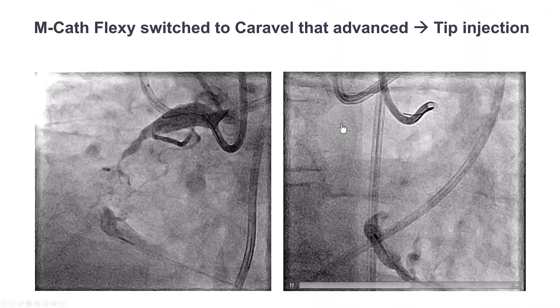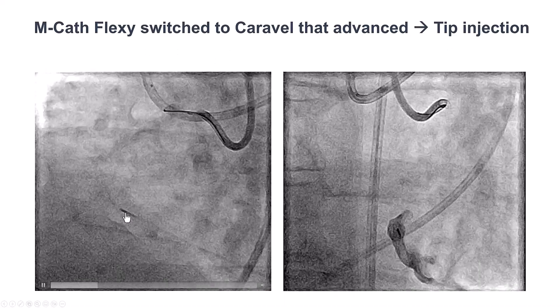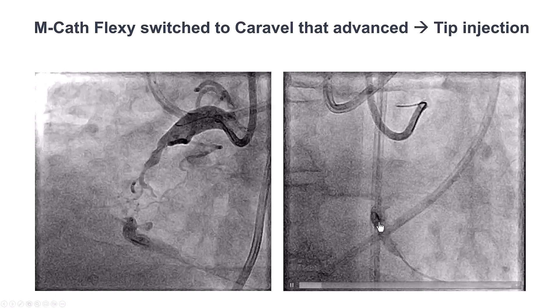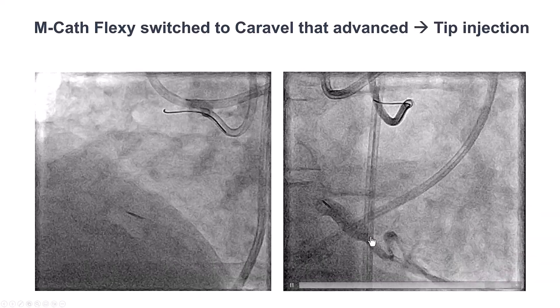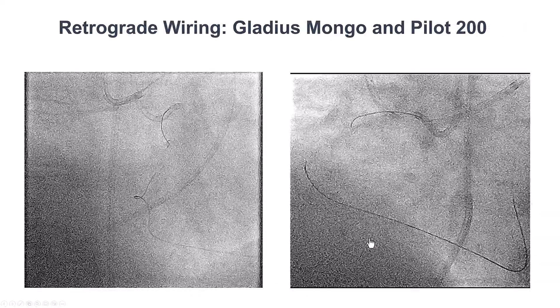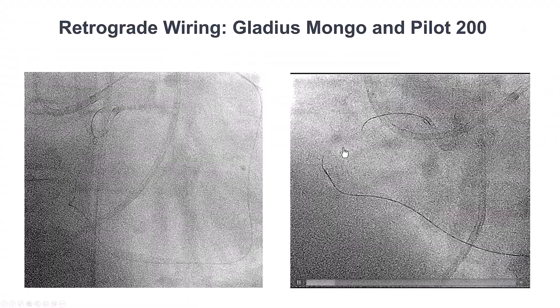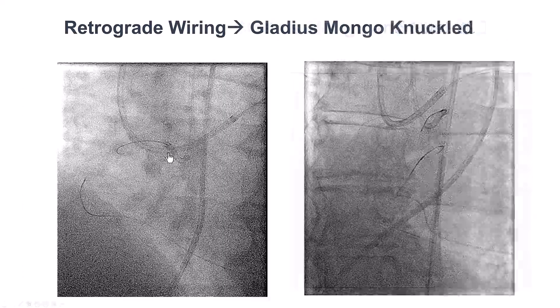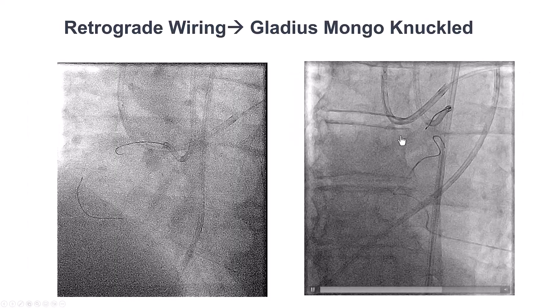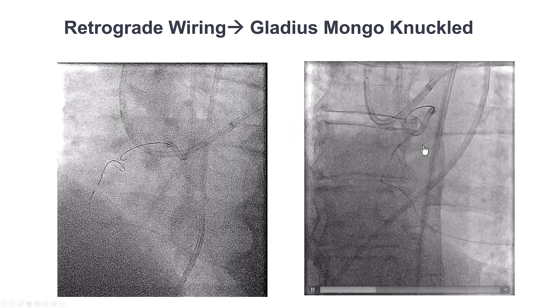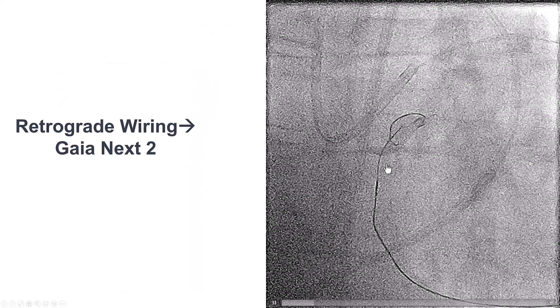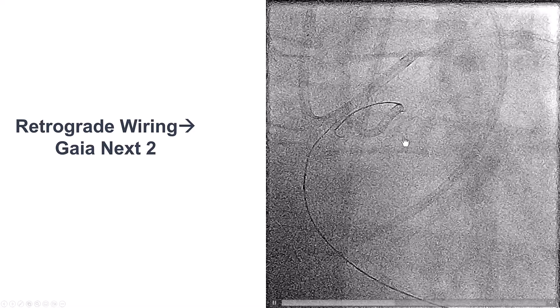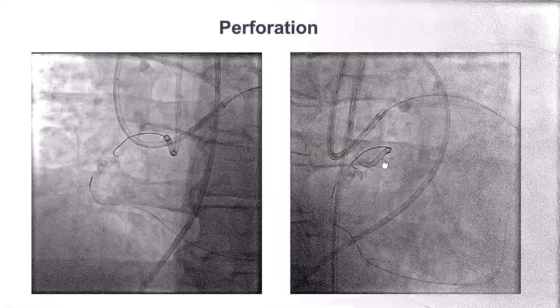We were unable to advance the MCAT Flexi, but we were able to advance a Caravel microcatheter all the way to the distal cap. A distal tip injection showed a relatively blunt cap distally. We tried with different guide wires — a Gladius Mongo and a Pilot 200 — attempting to knuckle them and advance close to the antegrade guide wire, but had significant difficulty. The guide wire entered into a side branch. We then switched to a stiffer penetrating wire, the Gaia Next 2, which advanced a little more, but its course was not following the antegrade guide wire, so we stopped.